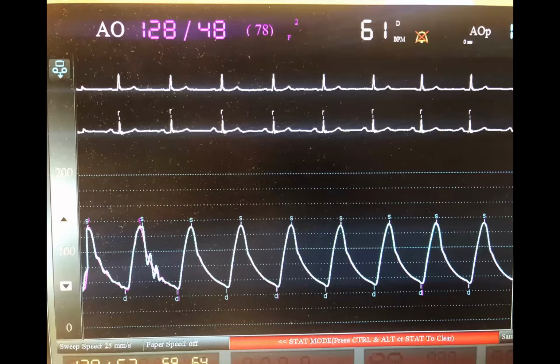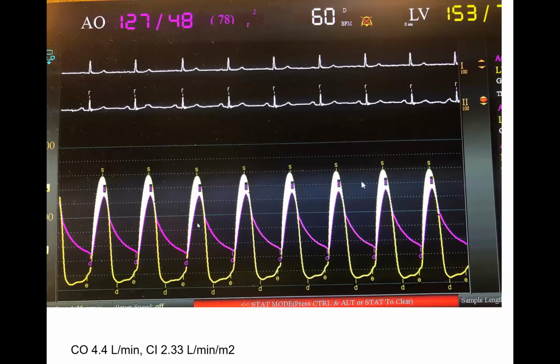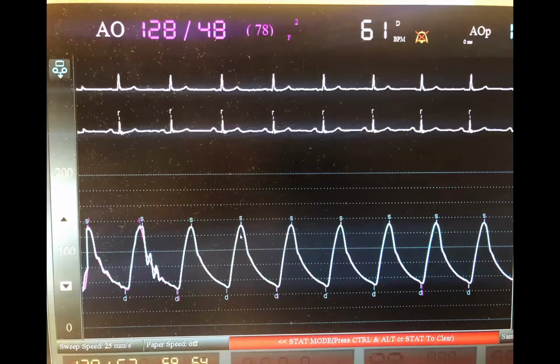That's why this is the final step. If you've corrected your tubing, you've swapped the transducer, obtained the same measurements, but yet when you pull back, they are not superimposed, the only thing you can do at this point is change your technique. Don't use Langston.